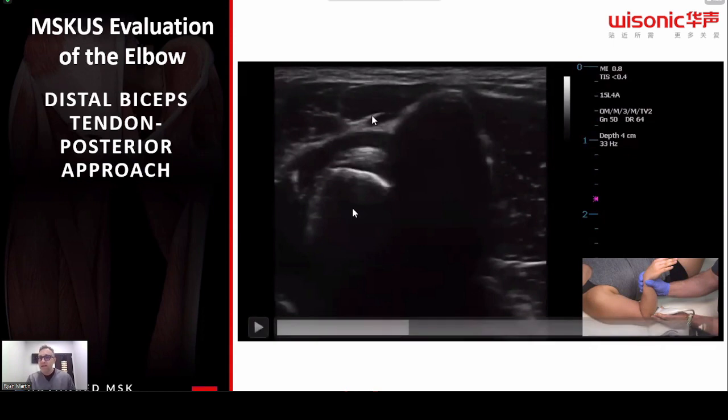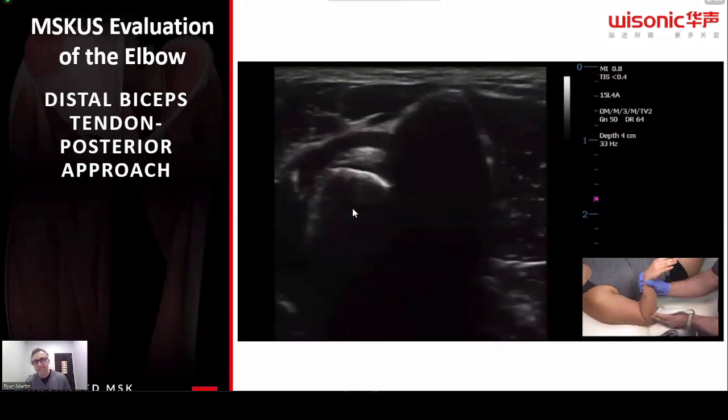Now again, this is a great area for interventional purposes because you can see right in here, if you put this arm right up onto the body and you have your probe right in this direction here, well, it's just easy access. And you can see all you would need to do is bring the needle from left to right, and you could drop it right into this space, and that will communicate with the tendon down the line. So again, this is a good view for that distal enthesis, and some interventional doctors like to use this view for injections into the distal tendon.